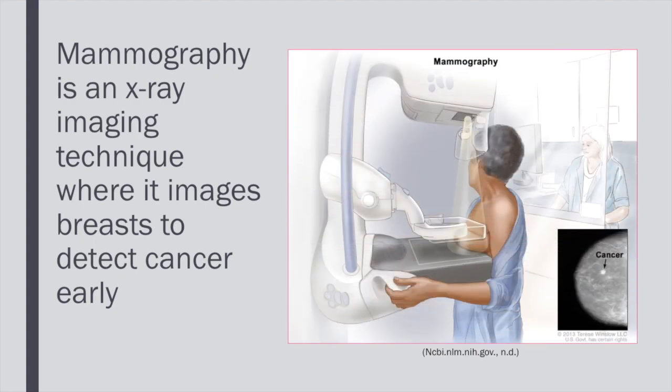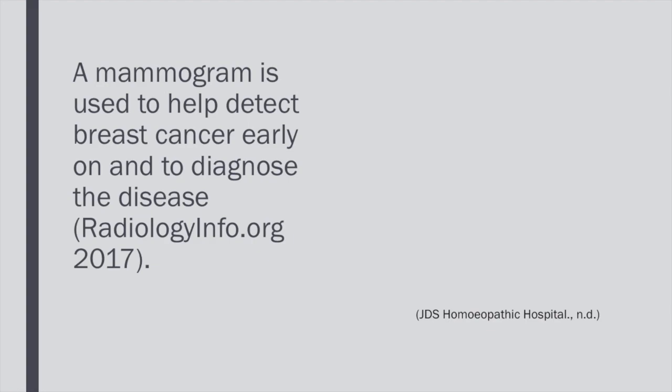What is mammography? Mammography is an X-ray imaging technique where it images breasts to detect cancer early. It uses a low-dose X-ray system to view the internals of the breast. The mammogram is used to help detect breast cancer earlier and to diagnose the disease.